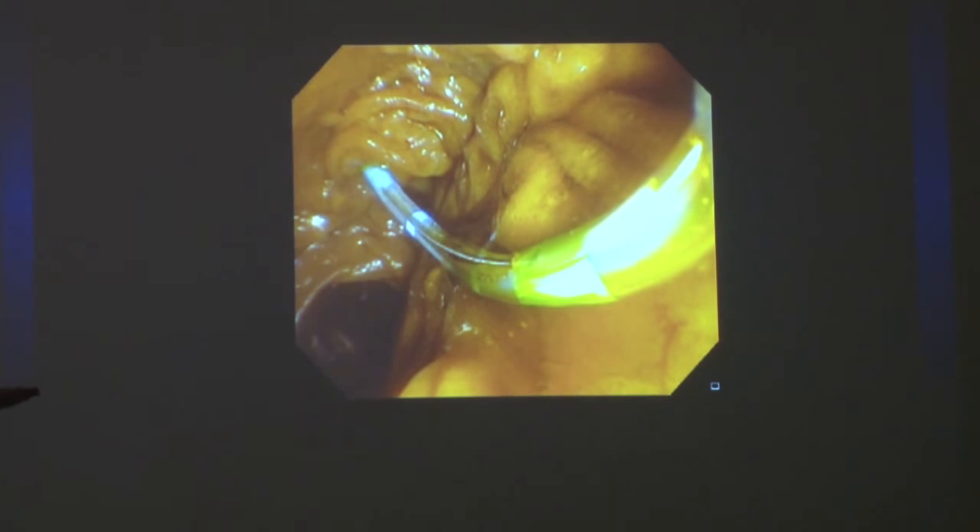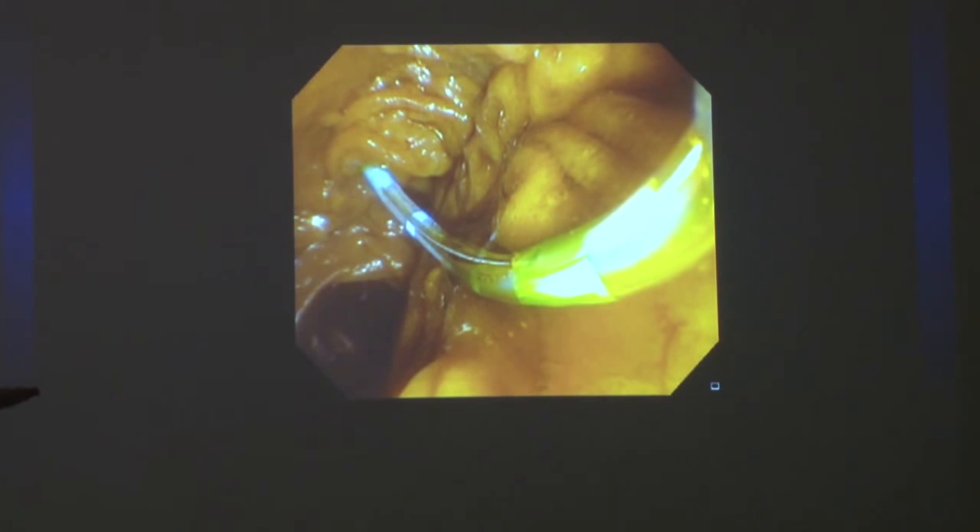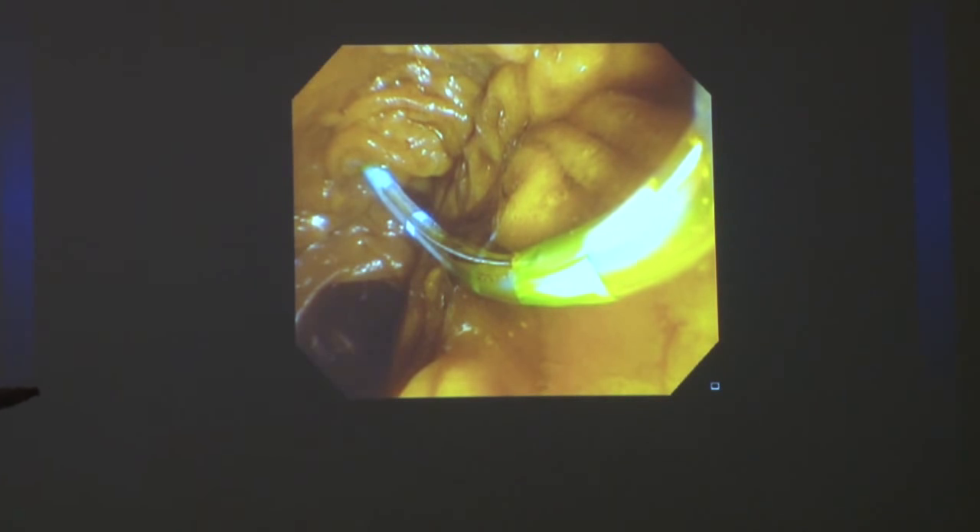As soon as I got engaged into the opening — you see how it's coming — I'm pulling the sphincterotome towards me and it just finds its way. Nothing is being pushed in; I'm just pulling it out. Then I injected a little air because the wire was still not going, but it was in a good position, and then the wire just goes in there. You can see the stone in there too.